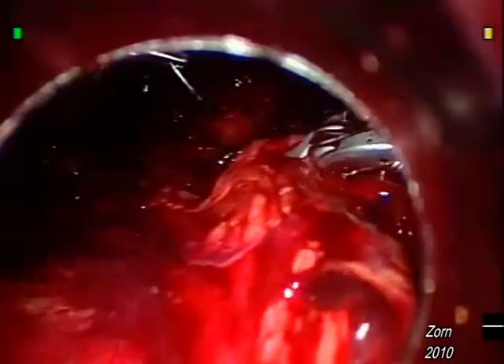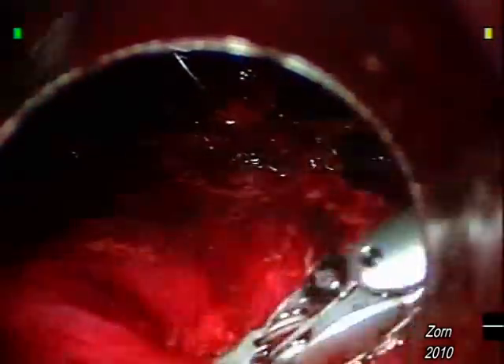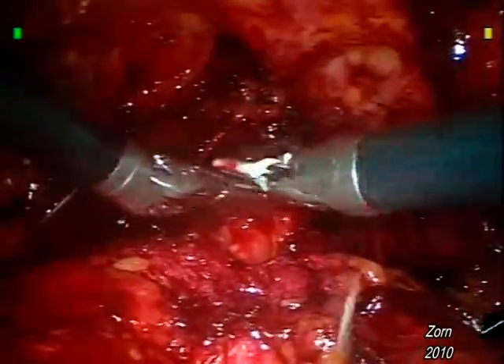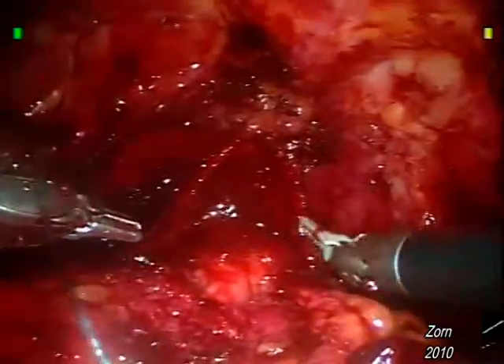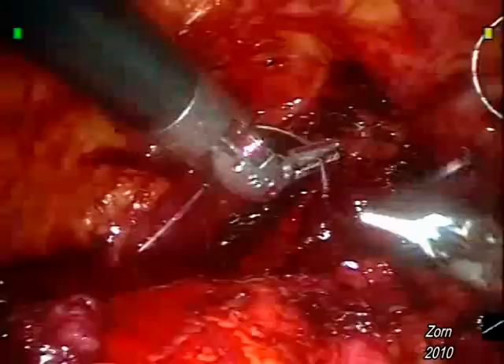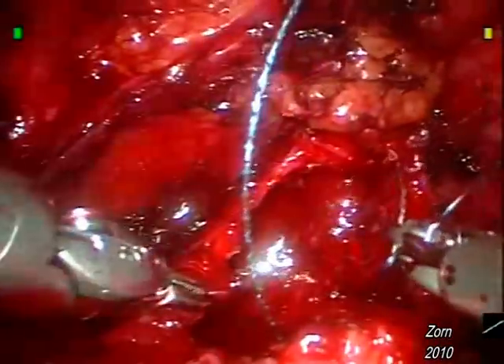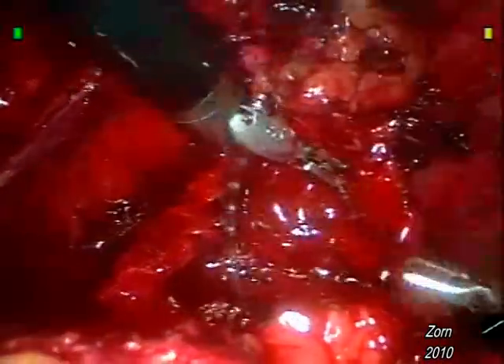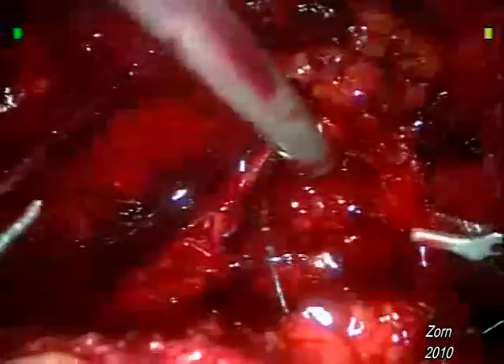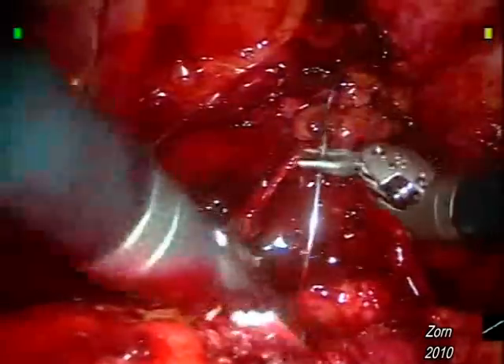Note the precision of the bites and the fluidity of hand motion. Here we see the assistant at the bedside detaching the grasp of the bladder so as to allow the bladder to be introduced deeper into the pelvis and bridge the gap. Here we can see a second bite of the posterior urethral plate, making sure not to injure the neurovascular bundles just adjacent to it.